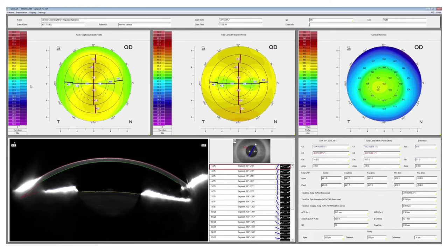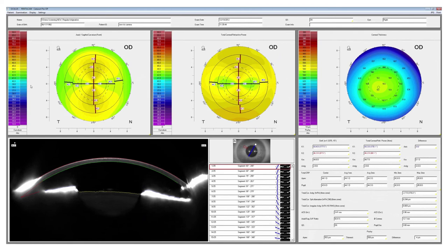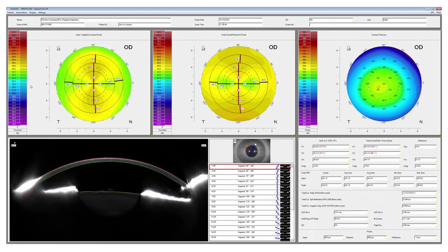For preoperative evaluation for cataract surgery we have our cataract pre-op display. This gives us our anterior surface curvature. It also gives us total corneal refractive power for looking at how the posterior surface of the cornea affects the total power of the cornea and this can be very helpful for toric IOLs. We also look at higher order aberrations which is important for assessing corneal quality and quality of vision and it's very important for multifocal IOLs or extended depth of focus IOLs. We also look at spherical aberration and chord mu which is related to angle kappa and that's also important for any kind of multifocal or extended depth of focus IOL.